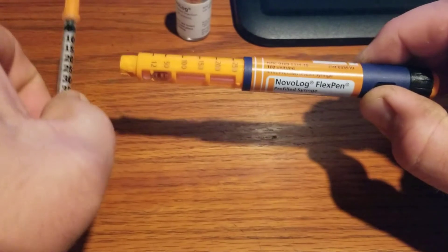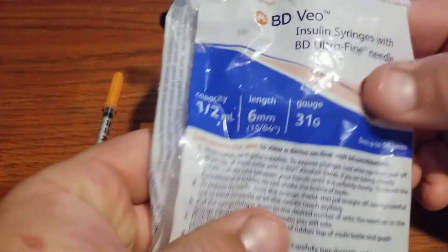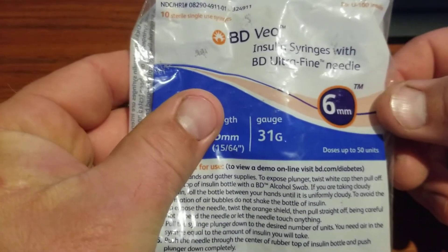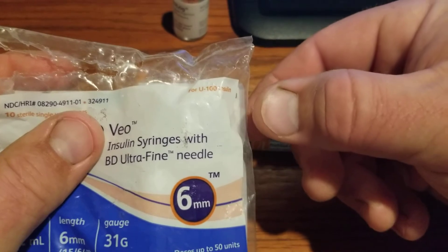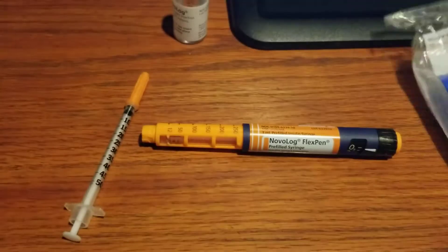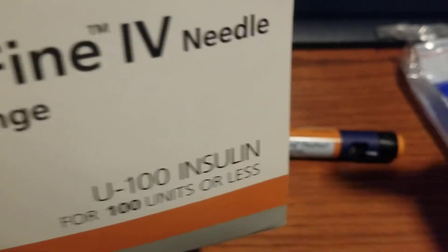I have the correct syringes. Normal syringes are only made one way, and if you look closely on the packaging you'll see they're for U100 insulin — and the box is also labeled for U100 insulin.